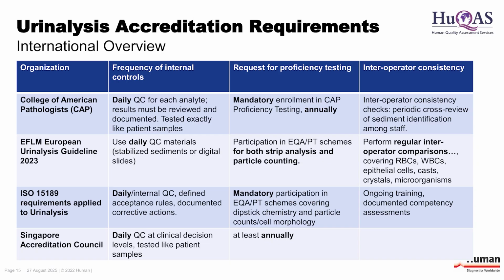The requirement for an accreditation would be that you should use the control material also in urine analysis on a daily basis, otherwise you would not be accredited in these countries. And the request for proficiency testing, EQA, would be at least once a year. That would be the recommendation internationally, just to give you an idea what is going on there.